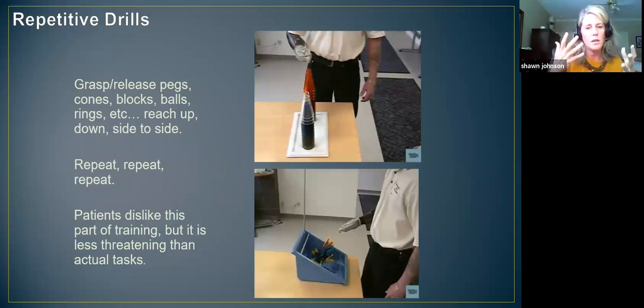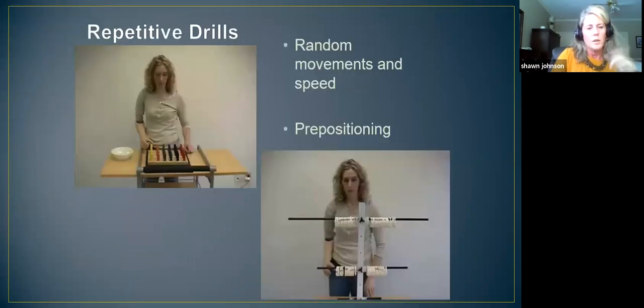Well, really, if the therapist can explain it to the patients differently, that there's a reason behind it. We want to repeat and do these things because if you drop a cone on the floor, it's less frustrating and threatening than a glass of water. So if we feel confident in this, then we can move on to actual tasks like holding a glass of water. So here's just some more examples of pegs and a little ring stand.